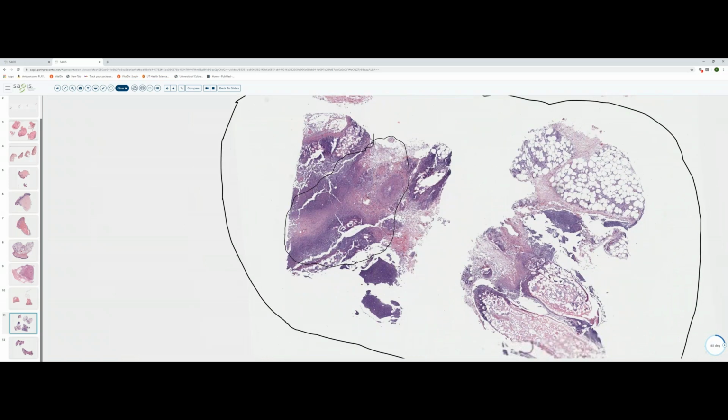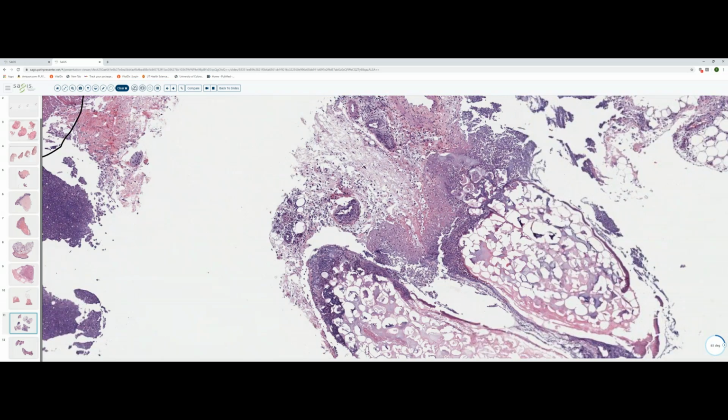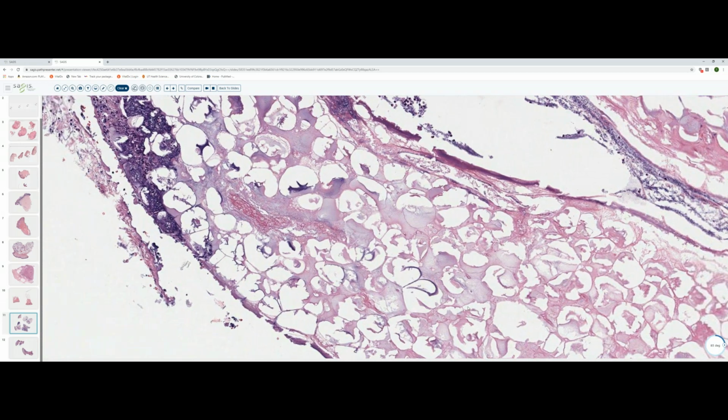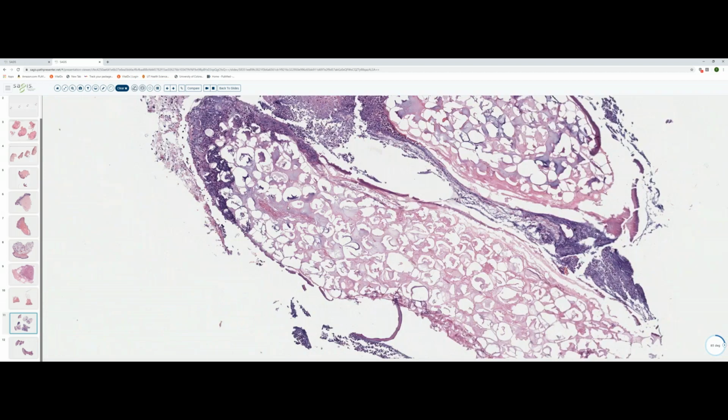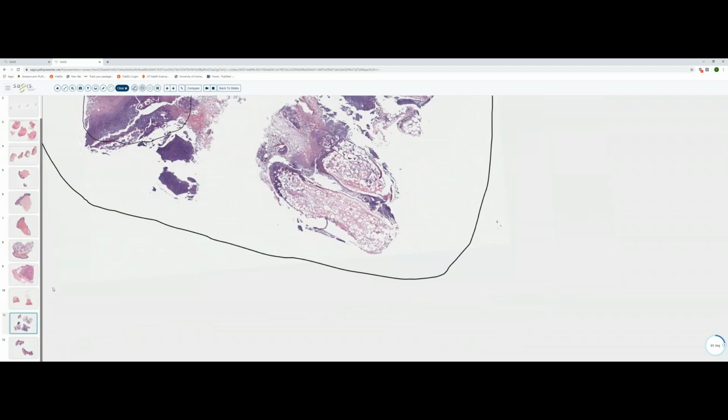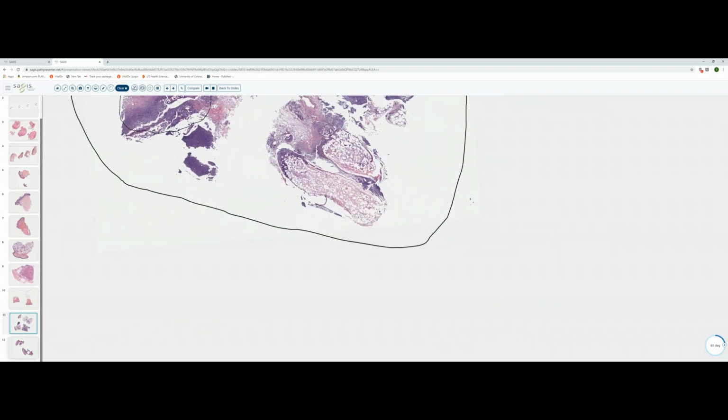Again, it's extremely testable. Again, some of the characteristic pink ghost cells that are necrotic with evidence of calcium at the periphery, so-called saponified fat. And of course, this is because the amylase and lipase have totally necrosed the fat. We always tend to think of pancreatic fat necrosis with pancreatic cancer, but the most common cause of pancreatic panniculitis is chronic pancreatitis.